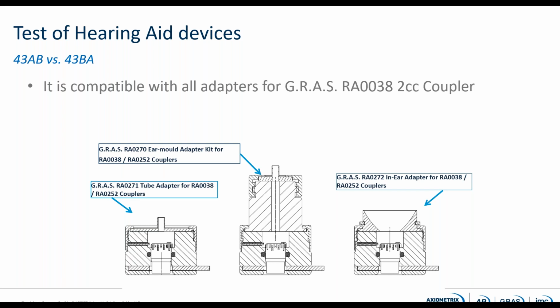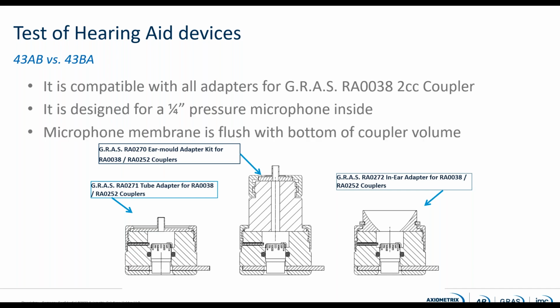So it's the same adapters you're going to use. The main difference is that we have a quarter-inch pressure microphone inside, and we have a lower coupler volume.